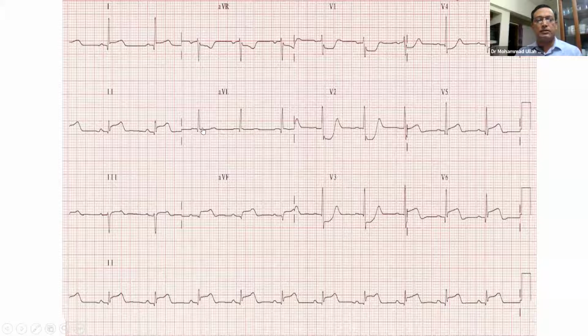If you look at the ST segment in aVL, it is isoelectric, no depression. So this also indicates an LCX lesion. And the ST depression in V2, V3 with upright T waves also indicates a posterior MI along with this inferior MI, which is also a feature of left circumflex artery lesion. So by all these things, we can define that this patient may have an inferior MI with the culprit artery being the left circumflex artery.